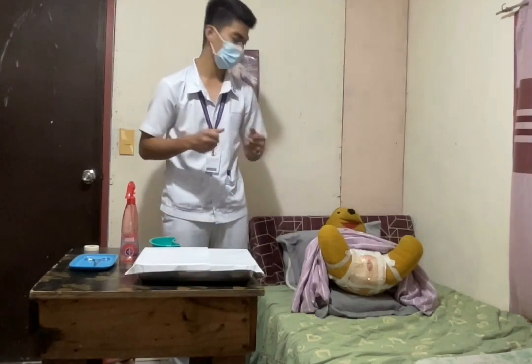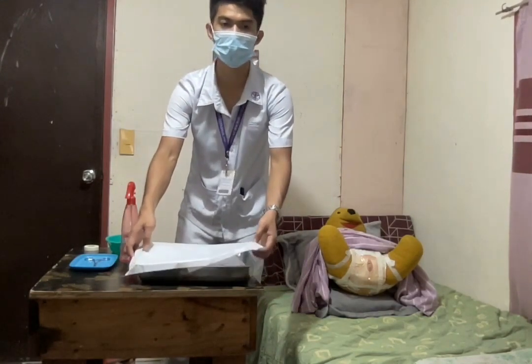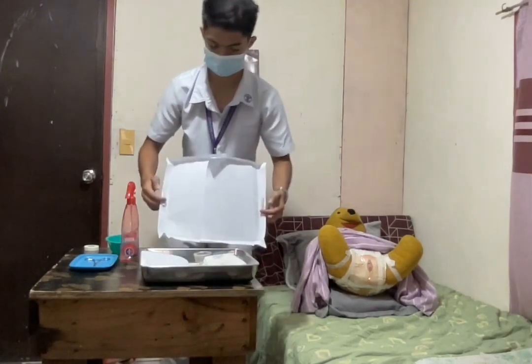Now, I'm going to apply direct light for visualization of the genital area. This is to ensure accurate and safe visualization of the procedure area. And now, I'm going to open the tray and arrange equipment for convenience, and accordingly to avoid contamination of sterile items. This is to ensure efficient and sterile preparation of all materials.